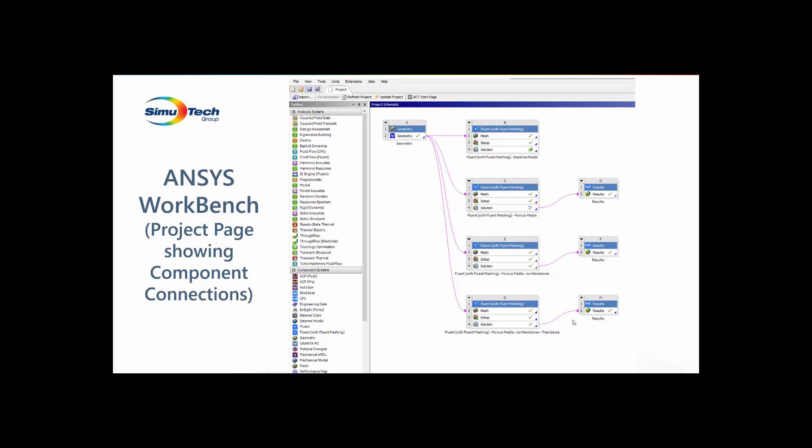I use this modular approach to evaluate several different fluid solutions. A baseline model, a model where I included porous media, the next model up where I had porous media and my non-Newtonian blood viscosity, and finally, the porous media, non-Newtonian, and now adding in residence time. Residence time is very helpful in identifying stagnant flow regions where blood could potentially clot.